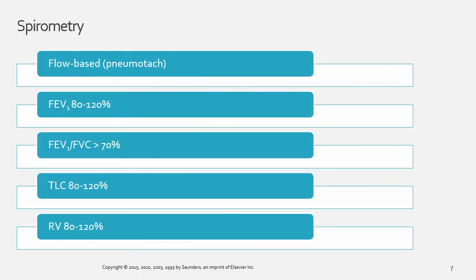Spirometry is a common test performed on children and requires active participation and cooperation to get acceptable and repeatable results. Spirometers come in two general types, volume or flow. However, flow-based spirometers using a pneumotachometer or other sensors for flow are much more common, smaller, and easier to integrate into a system.